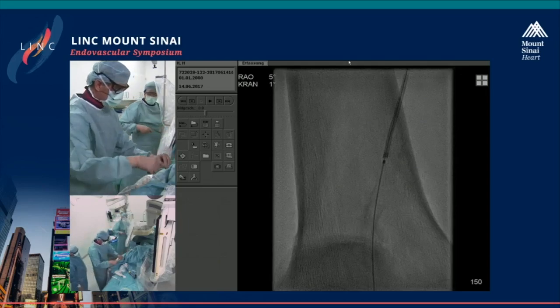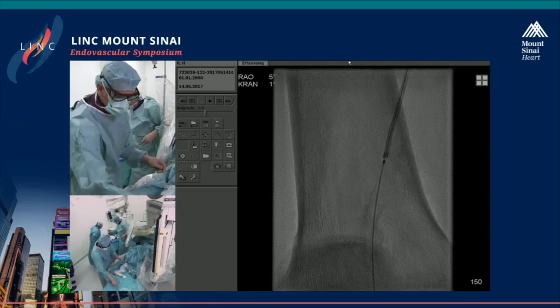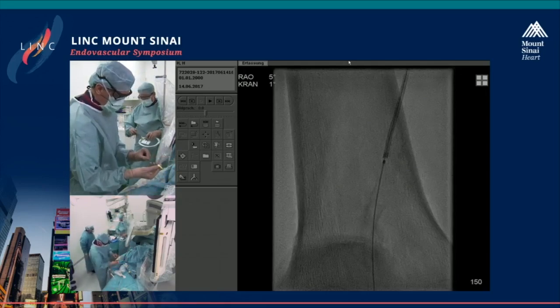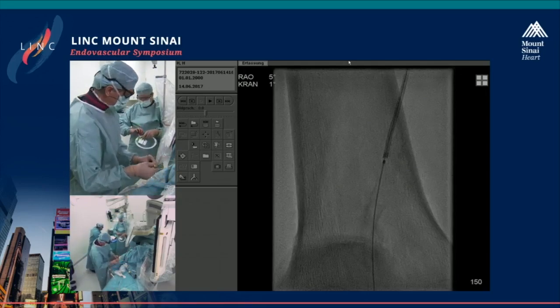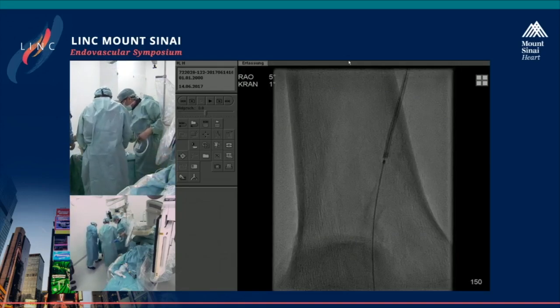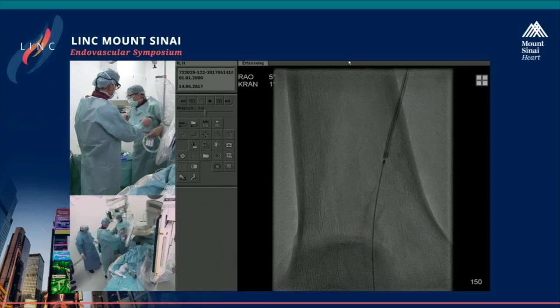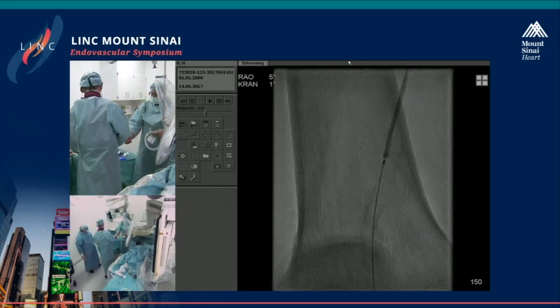Yeah. So that was already very nicely done, Andre, the crossing and so on. I understood your eventual strategy is here to use this micro-infusion system. Prior to that, you're going to just balloon the vessel, or are you planning anything else?